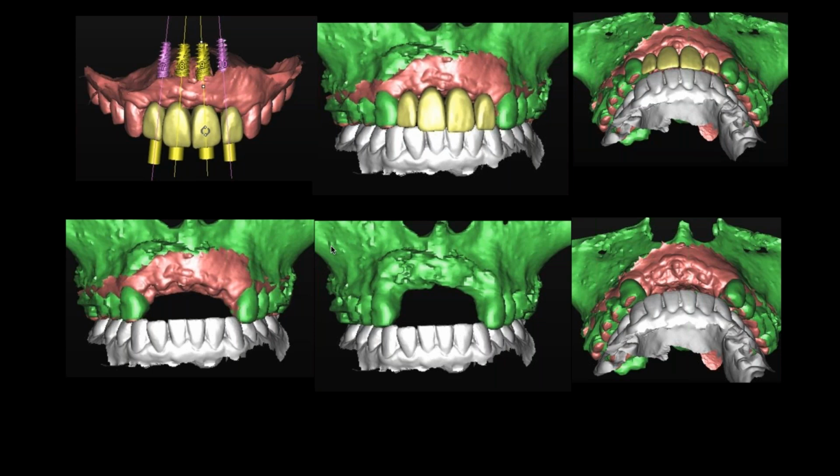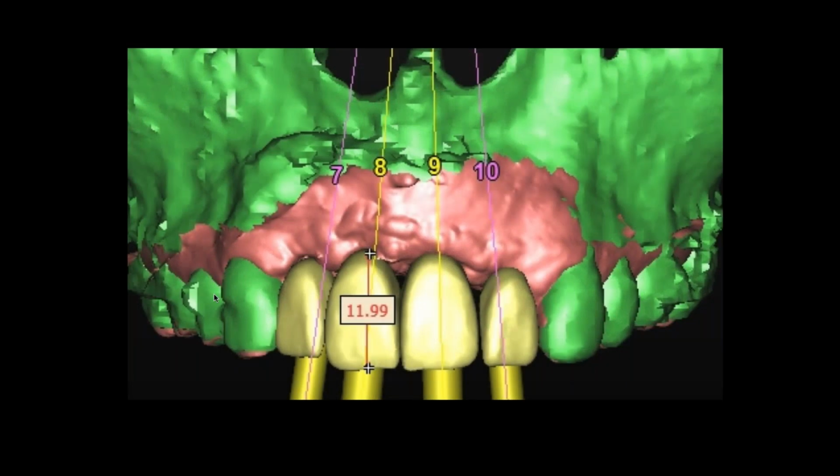A little bit long, but pretty close to where we need to be. And you can look at it on the occlusal over here, you can see that the width is reasonable. And then you can see the grafts that we placed in. So, poor girl. When you look at this a little closer and then you measure the length of the teeth, you see it's 11.99, and she's relatively petite. She's 5'2", kind of an oval face, so probably 10.5 millimeters is about the right height of her teeth. She can go to 11, but not much more than that. So we want to make some space and let the tissue come down. So I told her that most likely she may need a little pink on the gingival level, high smile line. But that 11.99 is telling me that we may have some problems with soft tissue.